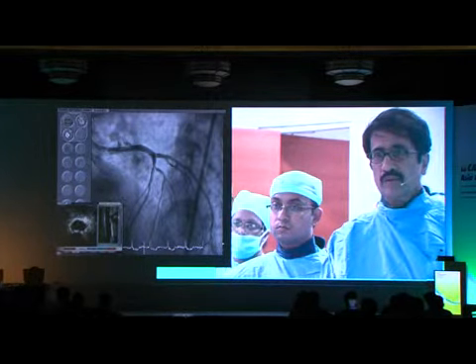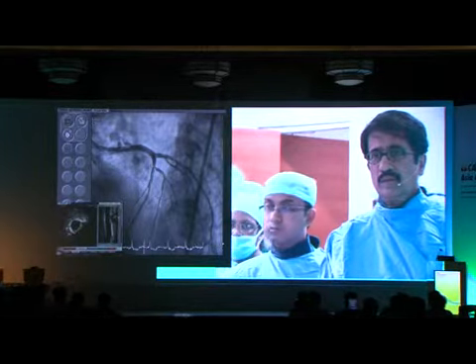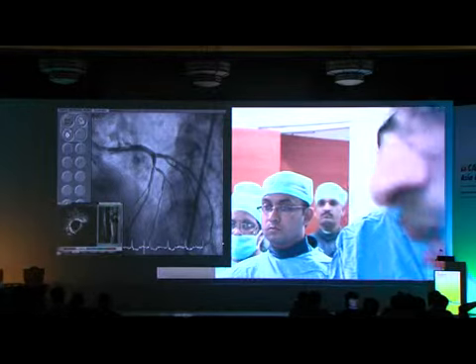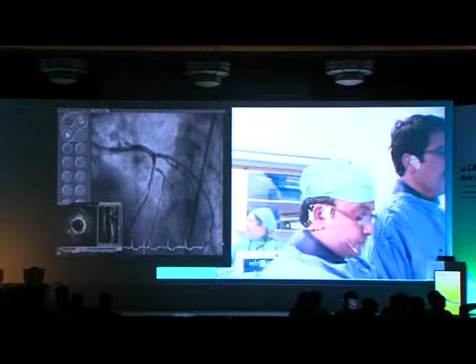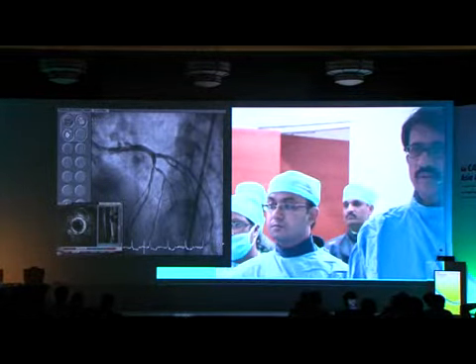Can somebody consider FFR in this patient for the LAD lesion? Kanolkar, would you like to ask whether FFR can be done in this patient? We'll show you the lesion pullback. Run that.